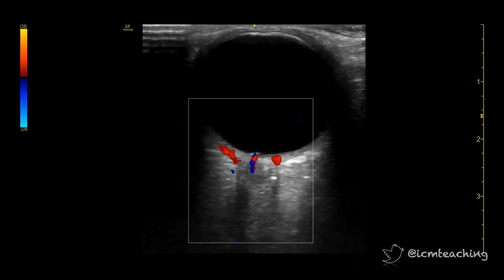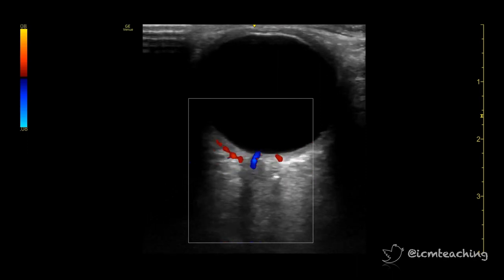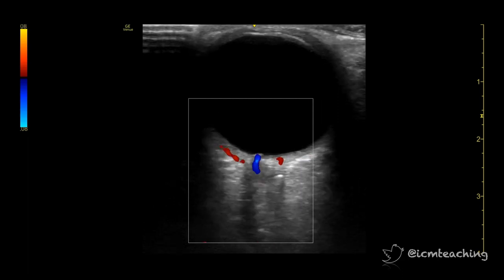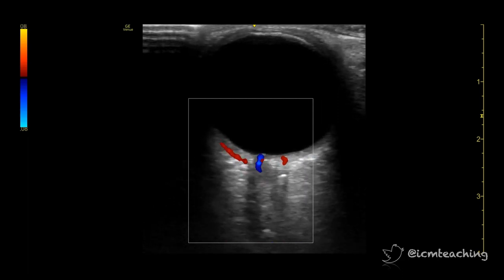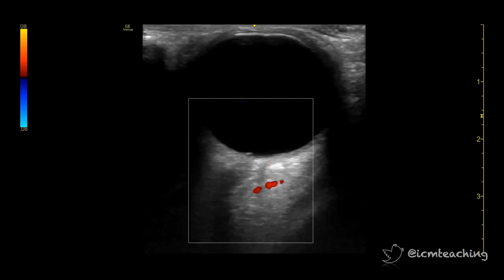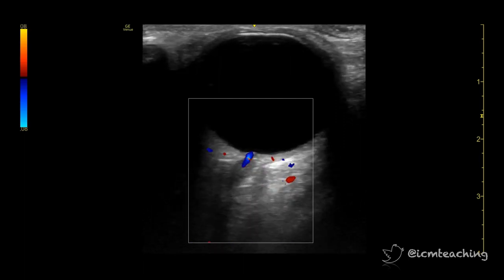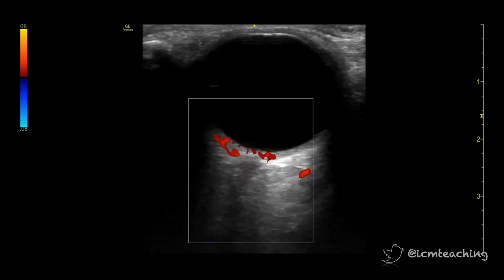We can see again how the course of the nerve appears to completely change depending on the angle we are looking at it. Here it starts by travelling to the left of the image, moves centrally, and then travels off to the right as I change the angle of inclination.